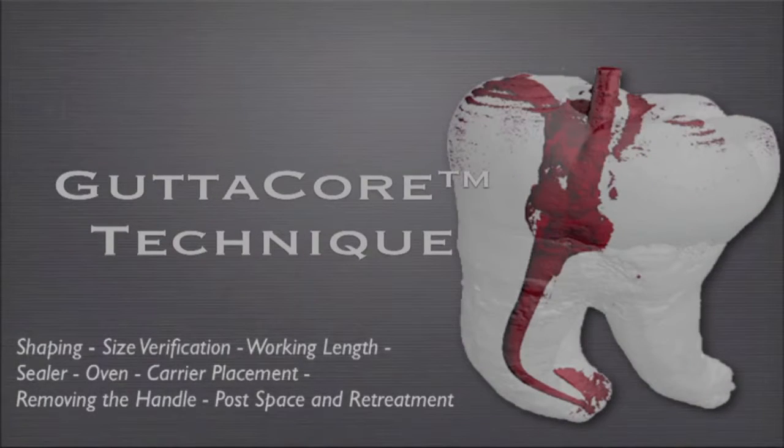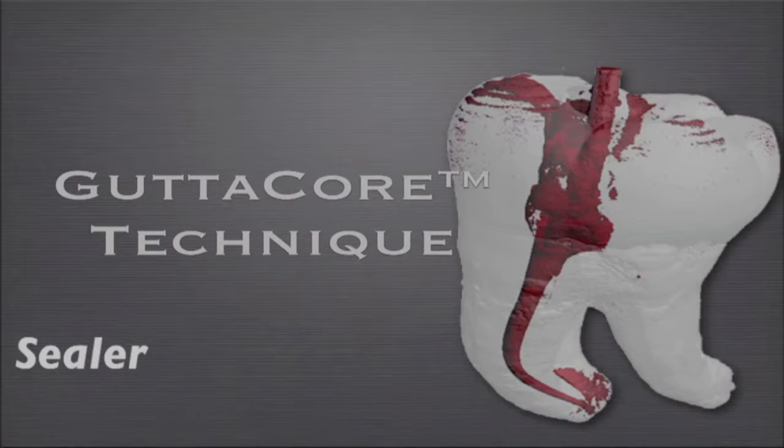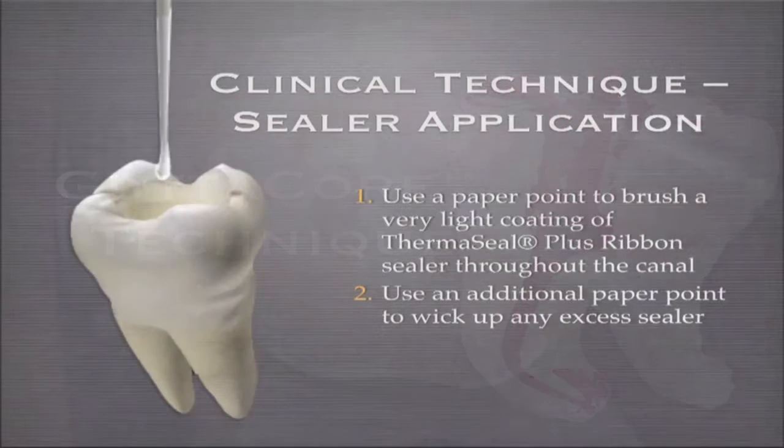Let's talk about technique — specifically sealer. When you think you have the right amount of sealer, you actually have way too much. When you think you have far too little sealer, you have the right amount.